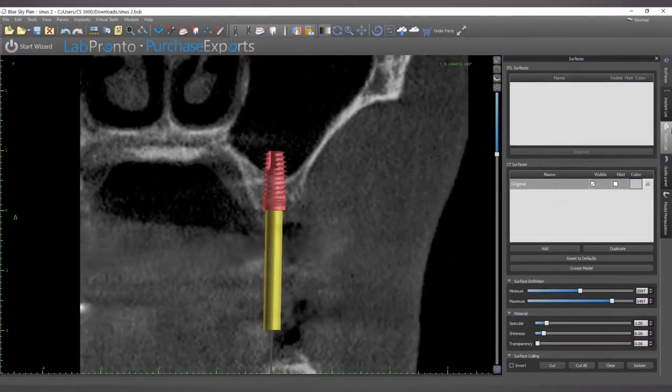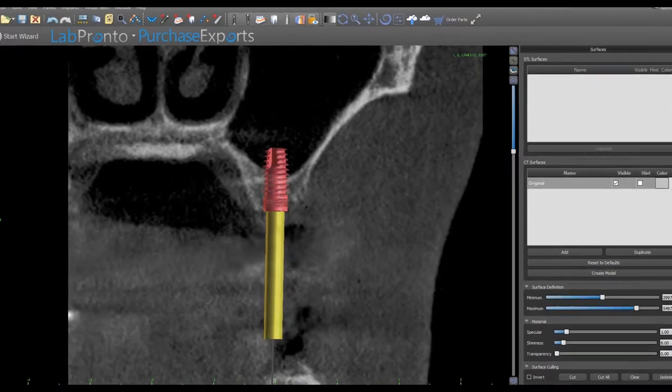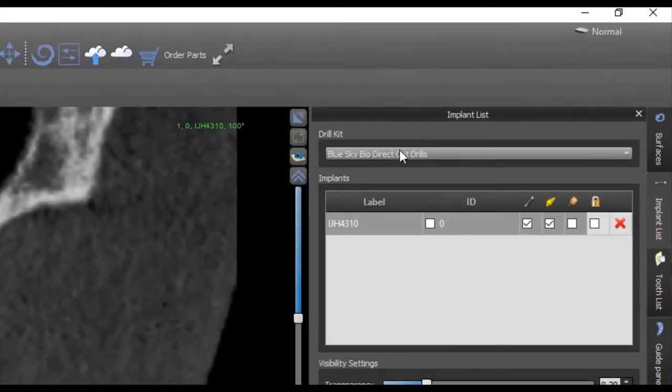The Blue Sky Bio fully guided crestal sinus kit allows you to safely breach the sinus floor while keeping the sinus membrane intact. Always begin by measuring the preoperative height of bone. This example will show how to lift the membrane to place a 4.3 by 10 millimeter implant with only 6 millimeters of native bone to the sinus floor.